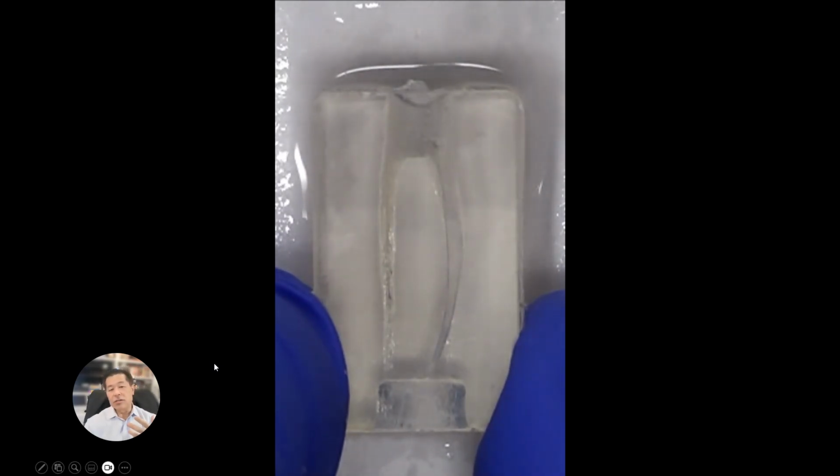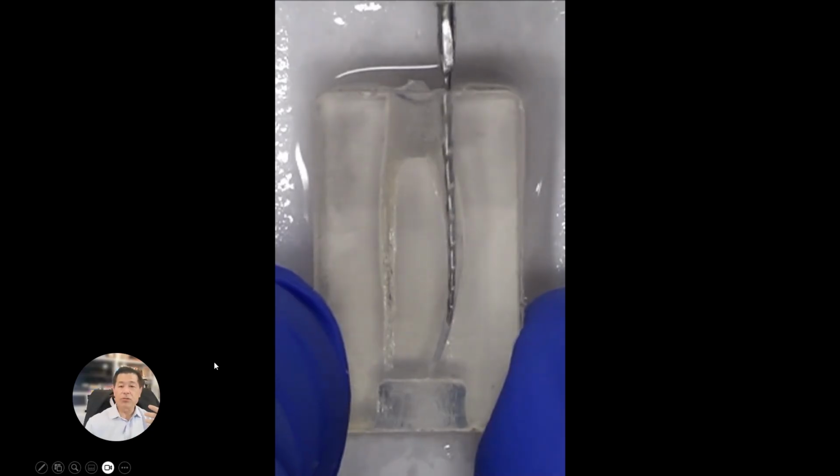It's the irrigation that's cleaning this out. And so that's what we have to remember. It's the irrigants that clean it out. And this is just a close up, showing that file going into all that suspended stuff. And so imagine you're doing that root canal and you're taking your mechanical files, whether they be hand files, rotary, reciprocating files, as you're going up and down, scraping that tooth, you're creating all that mud, just suspending that bacteria. So that's the main area that we're trying to clean out.